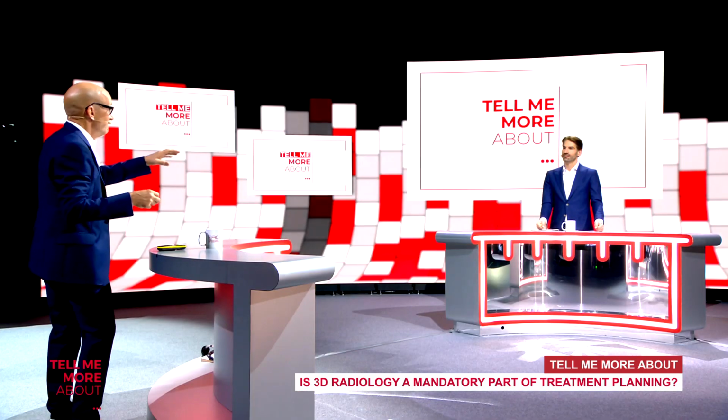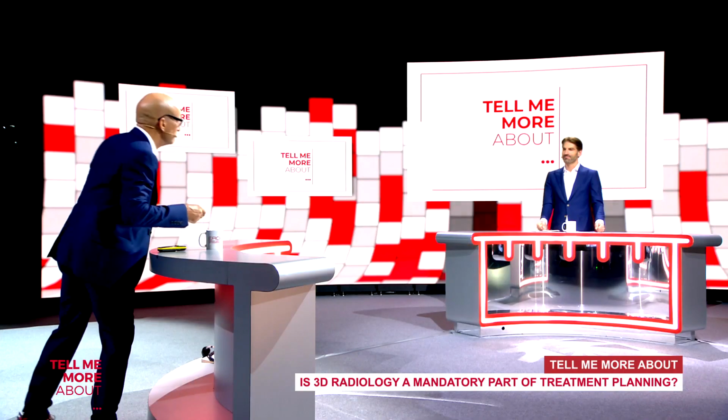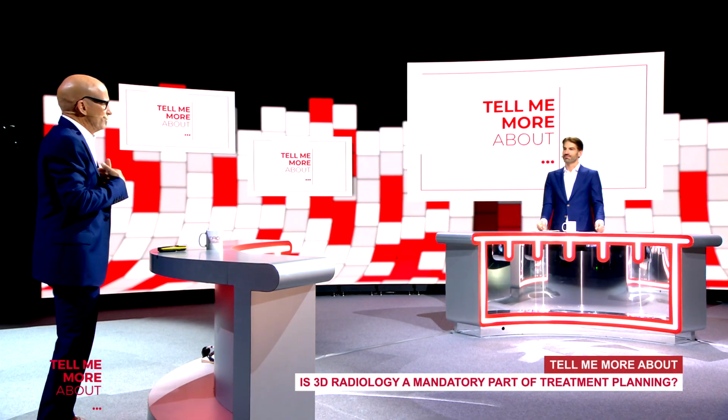This is not so easy as a surgeon to use, the dynamic navigation, because you sit here, like I'm here now, here's the patient, and here is my handpiece, and then you look here on the monitor, and then you prepare into the bone like this. You don't look at the side. This is not the normal way we as clinicians work. We see what we are doing, where our work goes in the bone.